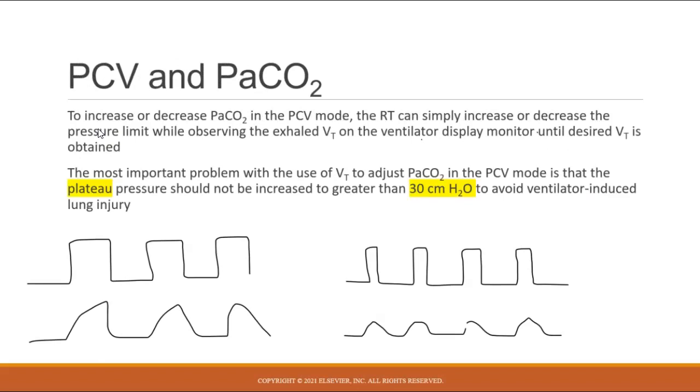If your patient is in pressure control mode, this is something that you guys forget a lot when it comes to testing because we're so used to seeing patients on volume control. If your patient's on pressure control, remember you're using the pressure gradient to create that volume. So, the same theory as how we're adjusting pressure support. I'm setting my pressures, again, to keep my plateau pressure below 30. But I also want to make sure that I'm achieving a tidal volume within that range.